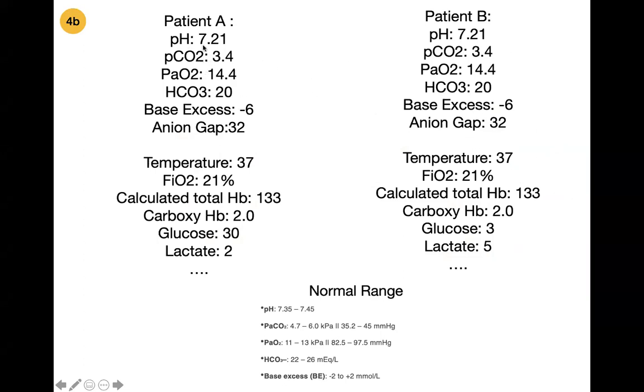So first of all, we're looking at that pH. That is a worrying pH. We've got an acidosis. Moving on to my respiratory, we're all comfortable with these. This is safe ground in OSCE. We can quickly say, happy with the respiratory, it is not a respiratory cause, because I've put ones that are very much either metabolic or respiratory, but in practice you can often get mixed variants. And we've also got a low PCO2, so we're starting to get some attempts at respiratory compensation to blow it off and reduce the acidosis, but we're not compensated. We've still got that acidosis.